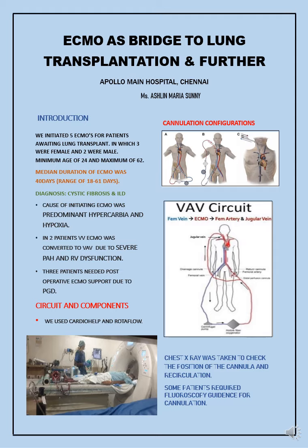Eventually, 2 patients were converted to VAV ECMO due to severe PAH and RV dysfunction. 3 patients needed post-op ECMO support due to primary graft dysfunction. We used CardioHelp and Rotaflow. Here is the picture of a patient shifted for CT scan on ECMO.